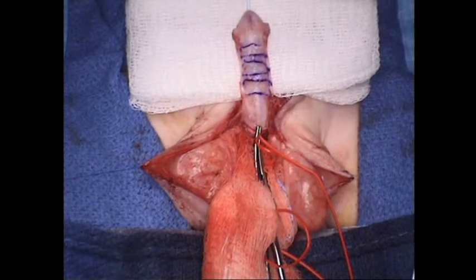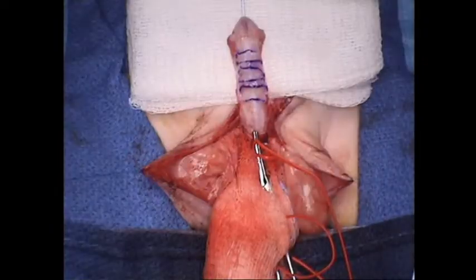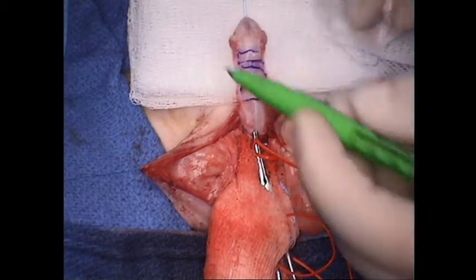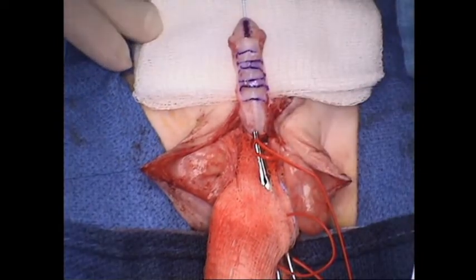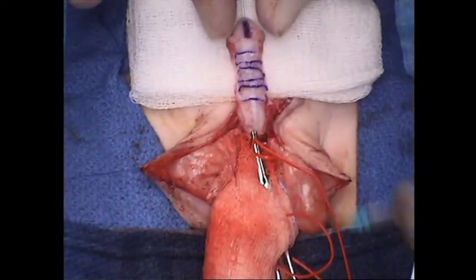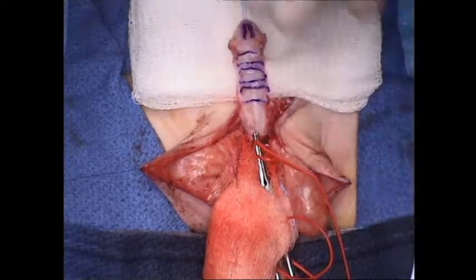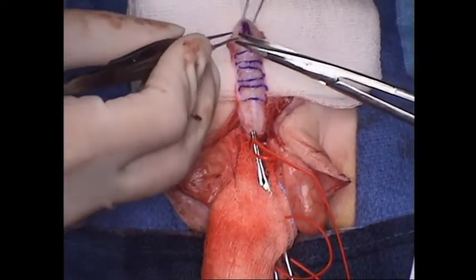Now you notice that we covered this plication suture. We just used a little 7-0 Vicryl to reapproximate Buck's fascia there on the dorsal surface of the penis, because we've noted that the skin can stick to the plication suture, to that Prolene, and it gives a really unnatural look to the dorsal surface of the penis. So again, all these little tiny points are to try to make the penis look as normal as possible and function as normally as possible. And it's not normal for the penile skin to be stuck to the dorsal surface of the penis.